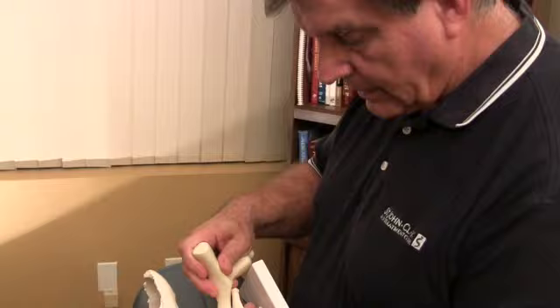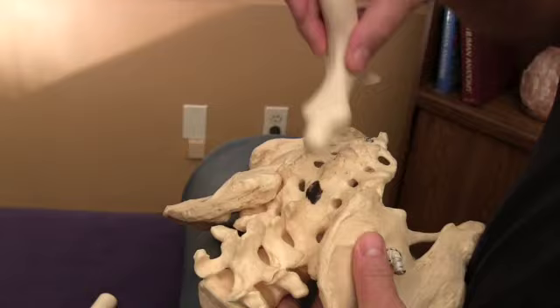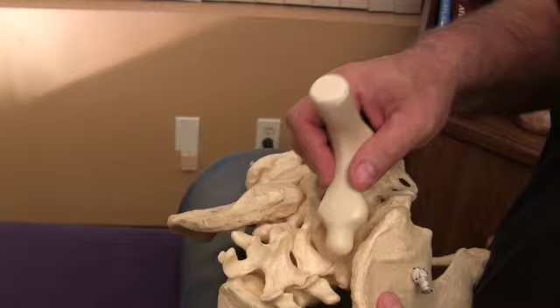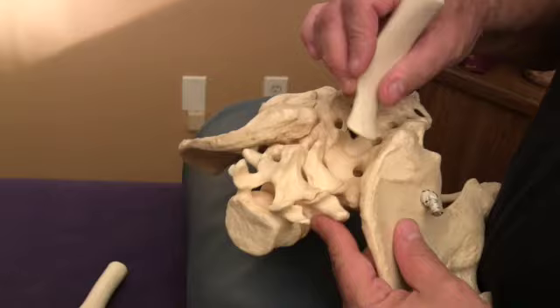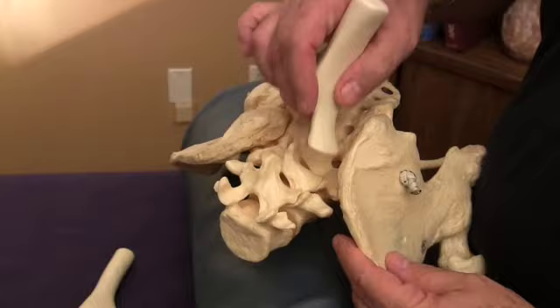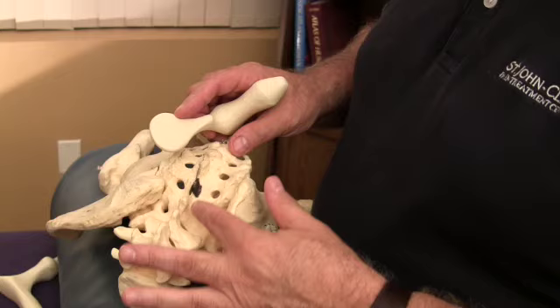This has a lot of application in the cervical area as well as the lumbar area. You can see how it fits in between the spinous processes. This is essential for opening up the lamina groove, treating the ligaments between L5 and the iliac crest, all around the fascial layers, the tendons of the oblique muscles, as well as the quadratus lumborum attaching below the latissimus dorsi. This just saves your fingers so much.